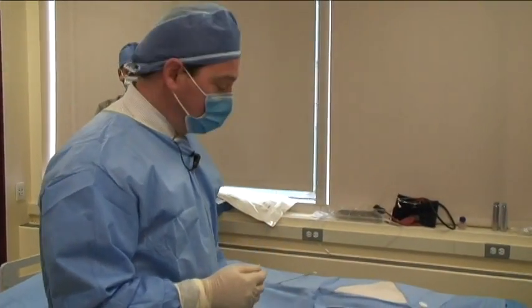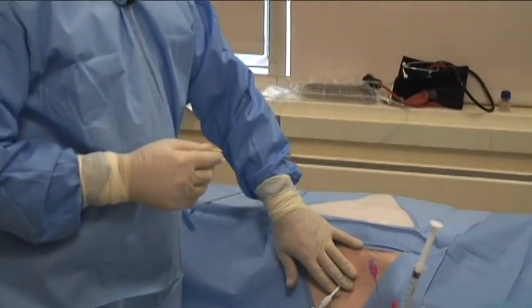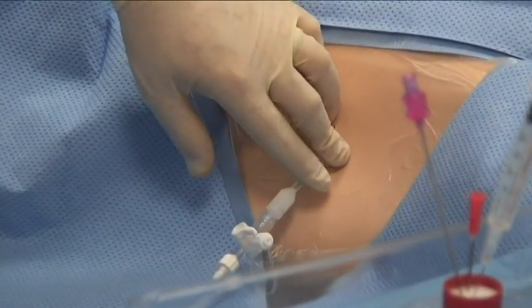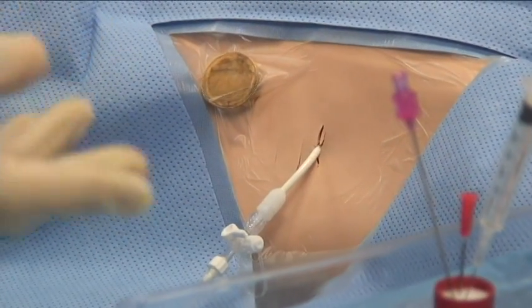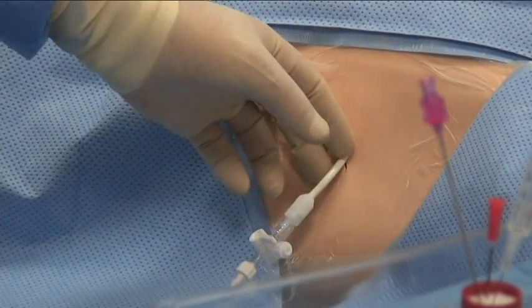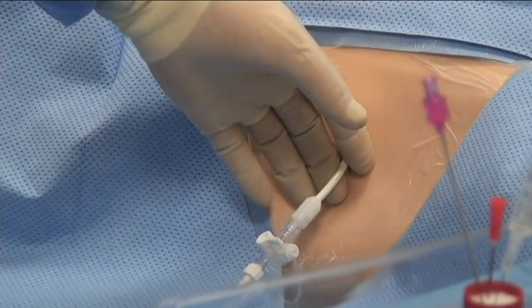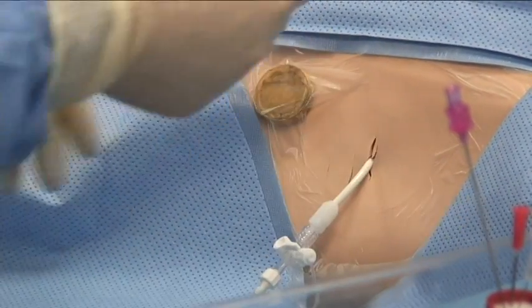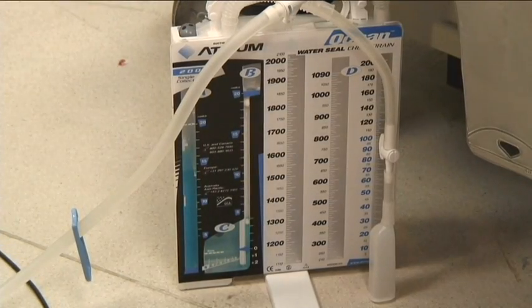I'd like to point out that in this example, we put the catheter in for a pneumothorax. However, we frequently put the same catheter in for a pleural effusion. The only difference being is that as I was putting the needle in, instead of air bubbles coming out, I may have seen fluid coming out, whatever fluid was in the chest causing the pleural effusion. In this case, with a pneumothorax, you may want to hook it up to suction.